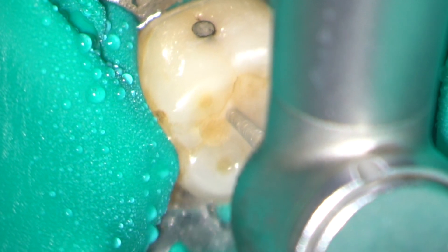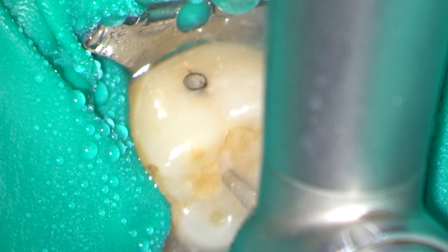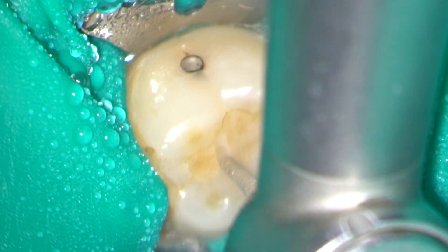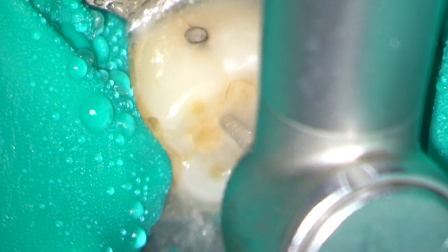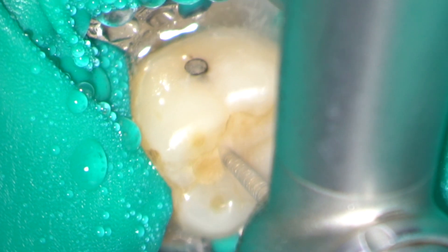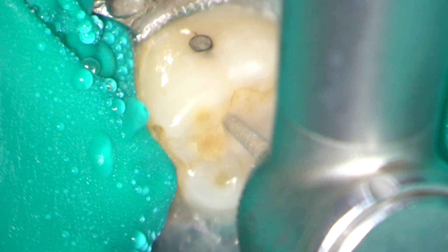Here we are clinically and you can see the buccal amalgam. I'm starting my access cavity preparation in line with this and I'm always keeping it in mind as I head towards the pulp horn.